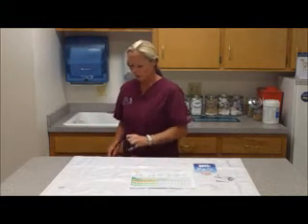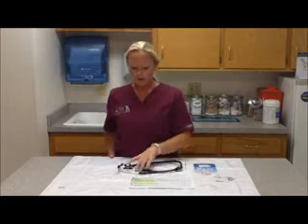This is task 6, and I'm going to go over the things that should be monitored during anesthesia. You want to measure the heart rate. You can use a stethoscope to make sure that the heart rate is good and normal.